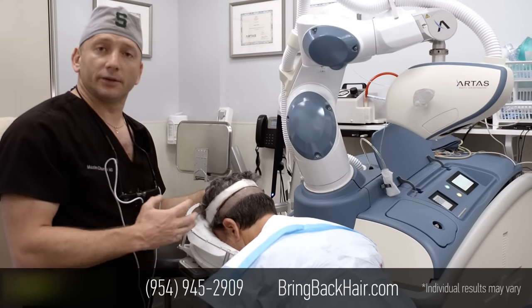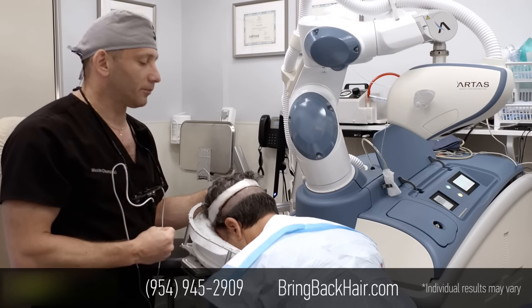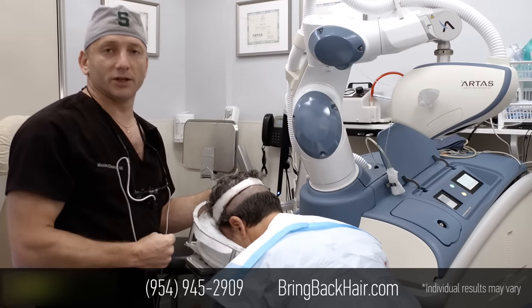We'll make sure that the patient is not having any pain during the extraction, and we'll give you updates as we go.